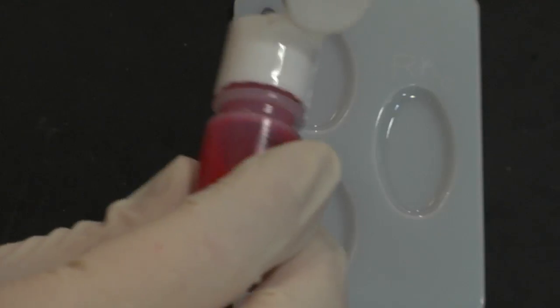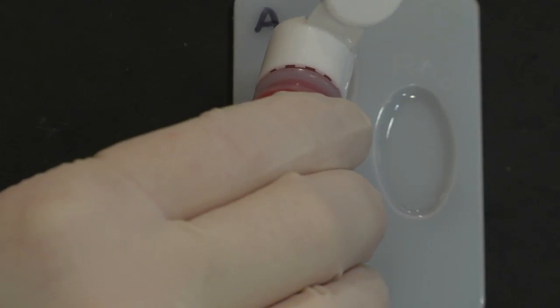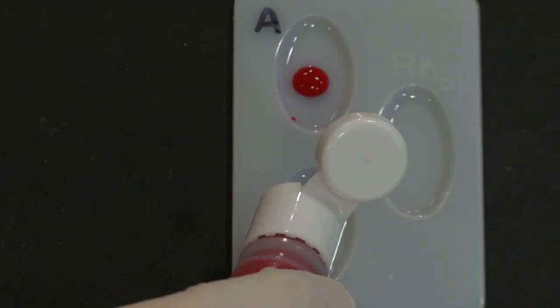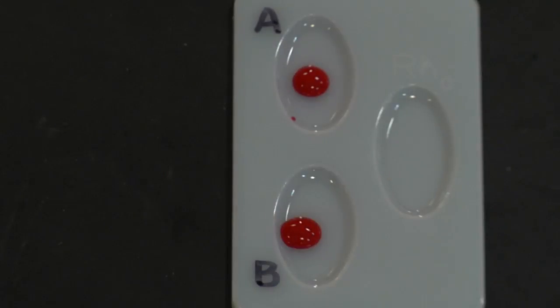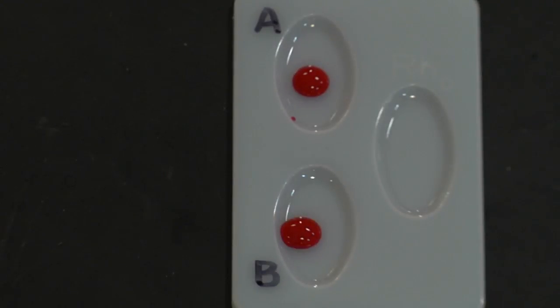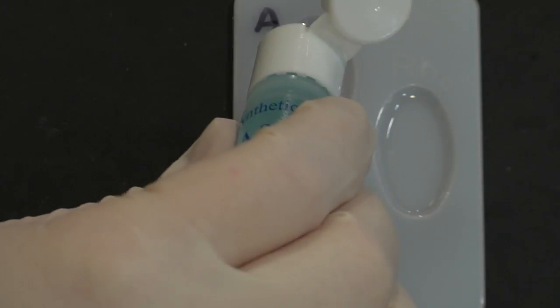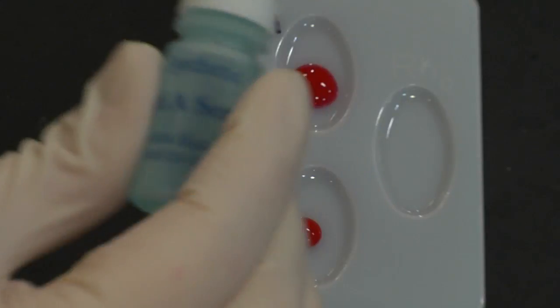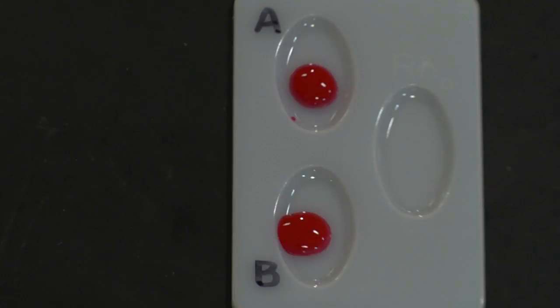I will start by placing one drop of the first blood sample in the well labeled A and one drop in the well labeled B. Next, I will place one drop of the anti-A serum into the well labeled A, and then one drop of the anti-B serum into the well labeled B.